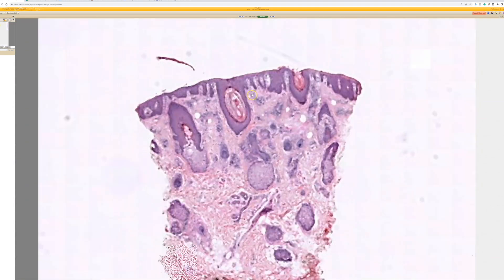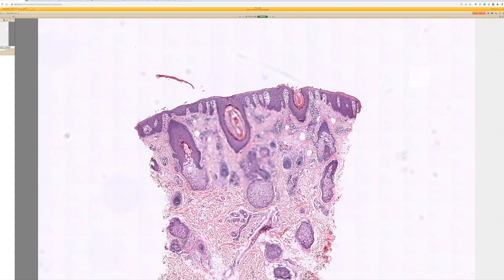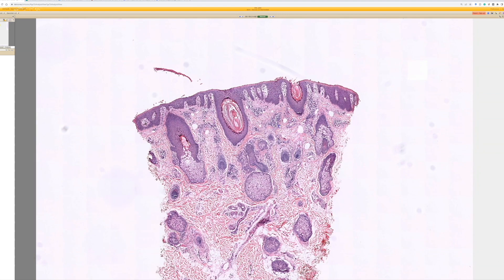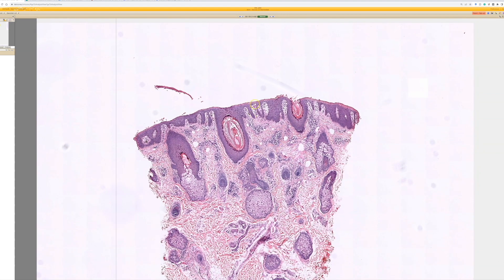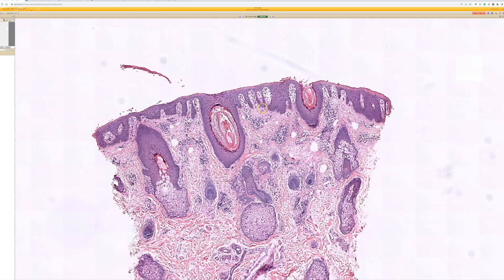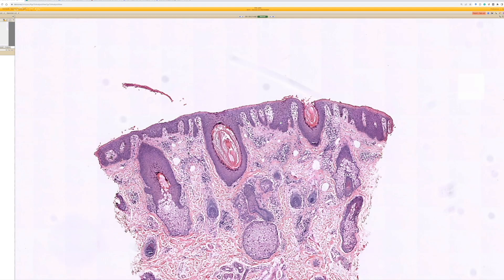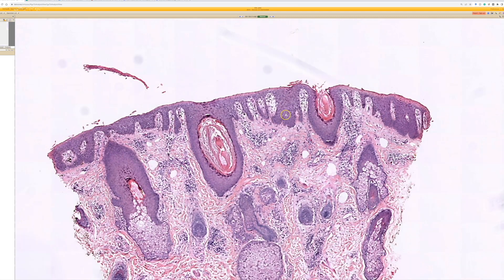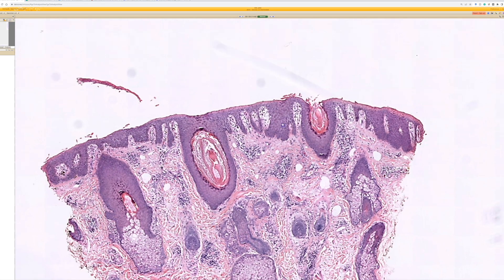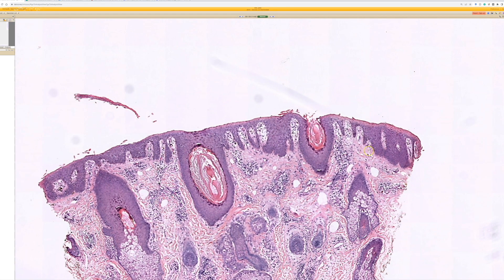This is a punch biopsy and we see mild inflammation with some papillary dermal edema. Going high power in the epidermis — what's wrong with this epidermis? There is no stratum corneum.